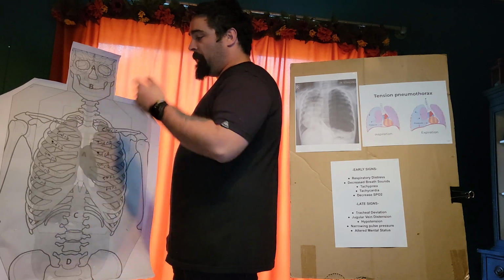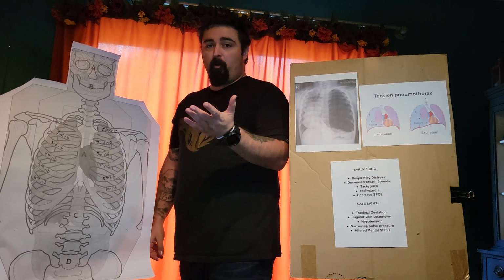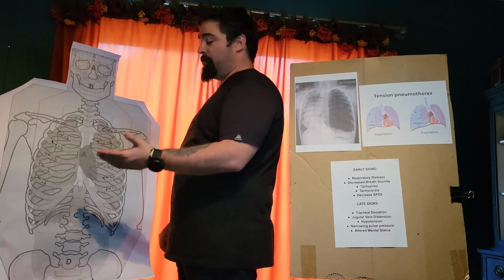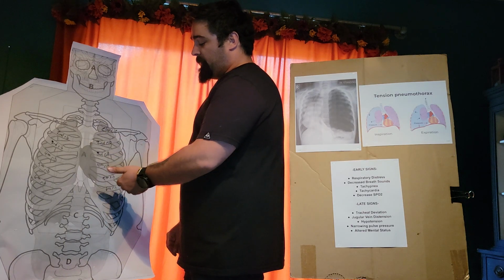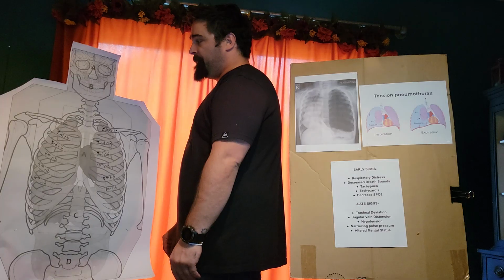And of course, when we're performing these skills on patients and in training, we will have appropriate BSI. For the indication of this class, all that is annotated is presumed that we are going to have BSI for the purpose of the class here. I'm just going to show you the appropriate sites and the appropriate technique to perform the skill here.